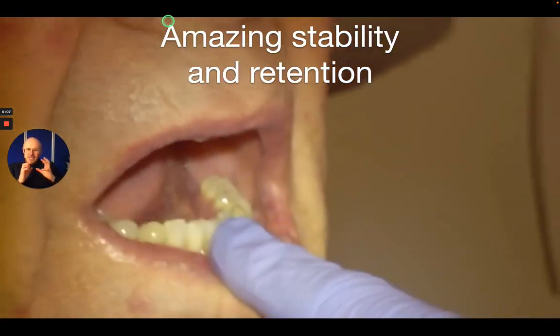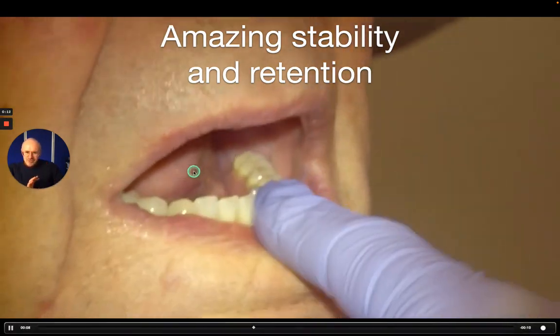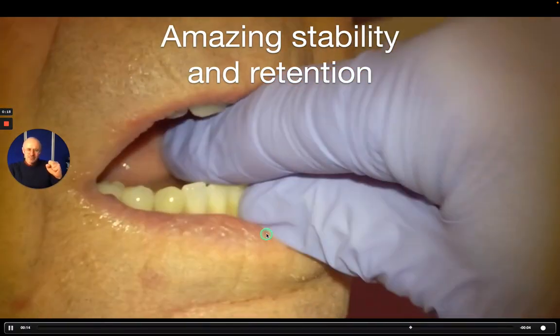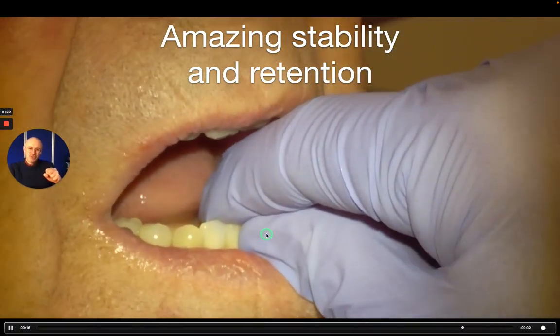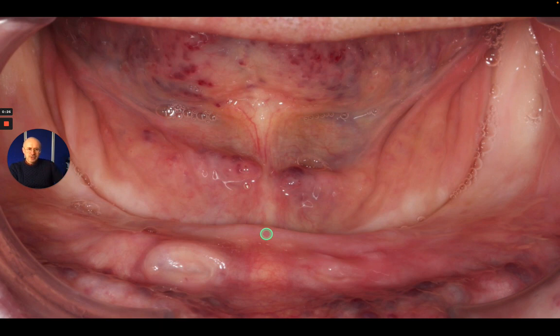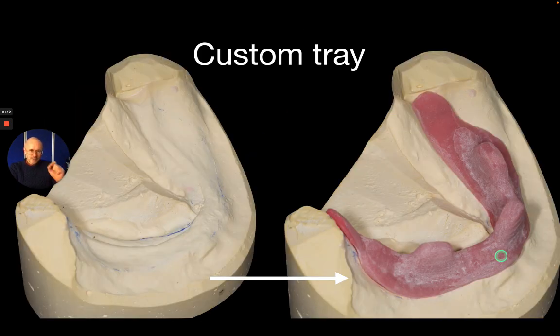Hi there. So how do we get a really great fitting denture just like this, that sits within all of the soft tissues and is really solid — you can push on that — it's got great stability and also good retention, with some suction when pulling on it. The secret to this is to record a superb impression of that area. It's all about the primary impression being overextended to produce a perfectly extended special tray, and I just want to share with you the design of that special tray and exactly how to do that.